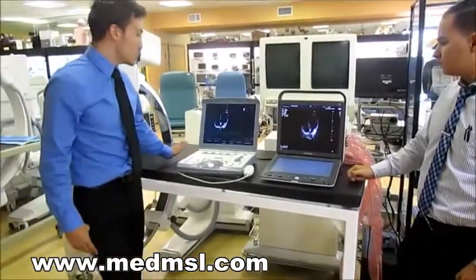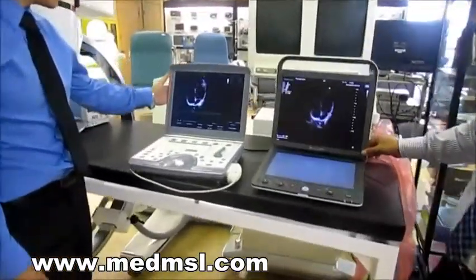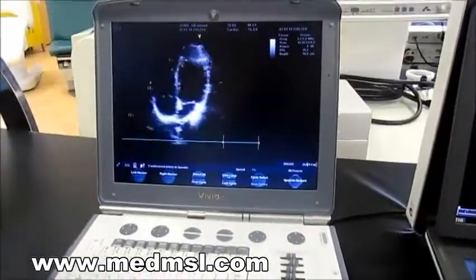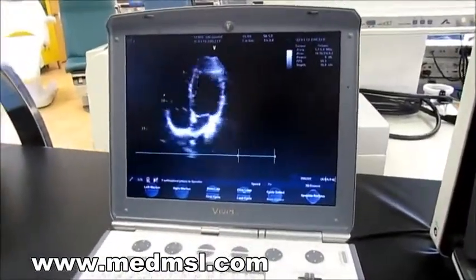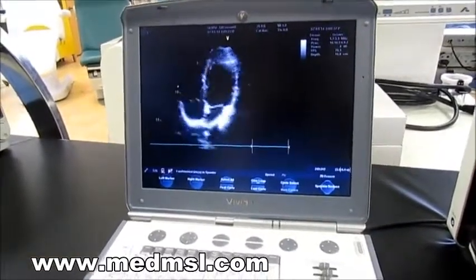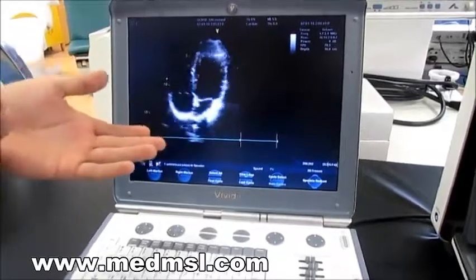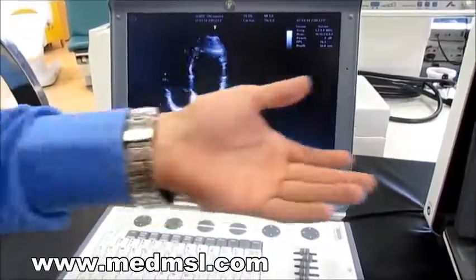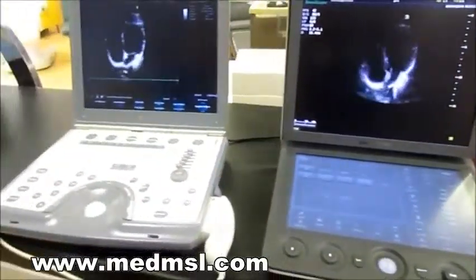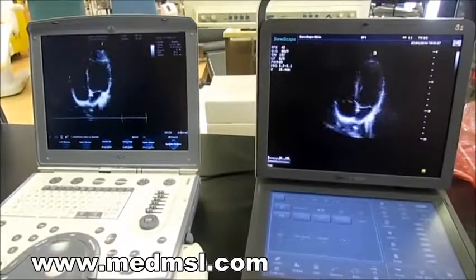The first thing I want to point out is the image quality. If we can come over here a little closer to the Vivid Eye — a lot of people think that because GE is such a big brand and they've been in the game for a long time, it's going to give you the best overall quality. We can actually compare this — it's the same patient, the same image — and compare it to the S9 to see if you're really getting your money's worth out of both systems.